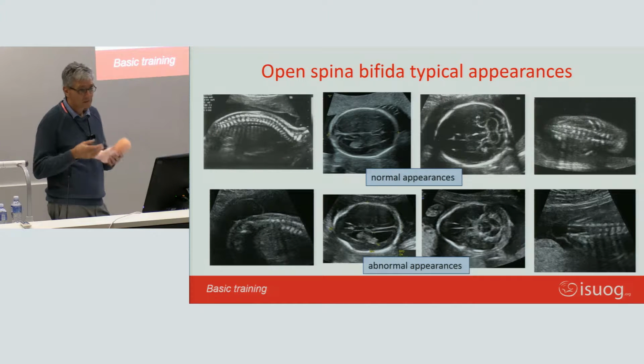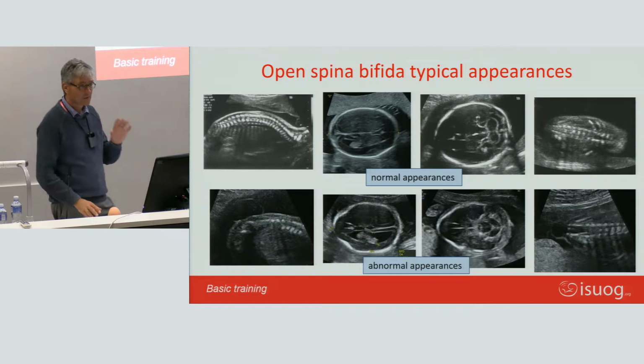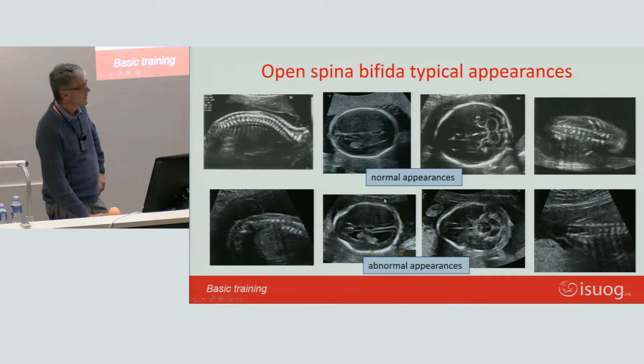I mean, even a relative junior at scanning should be able to pick up close to 90% of spina bifidas. And what do we see? There's a nice normal head, another nice normal head in cerebellum. Here we again see that head with a large ventricle, lemon-shaped. And what is this normal dumbbell shape of the cerebellum is now suddenly changed into a banana shape.